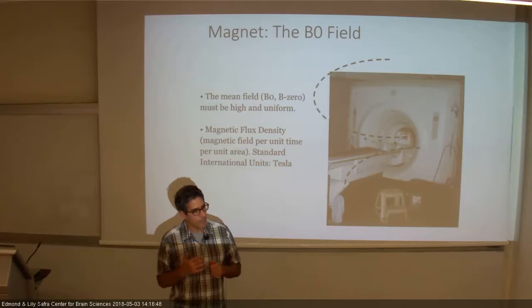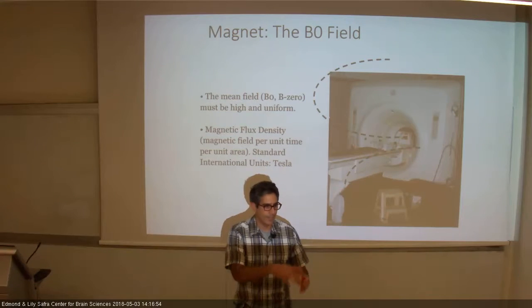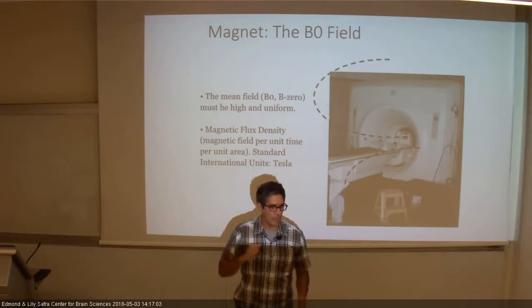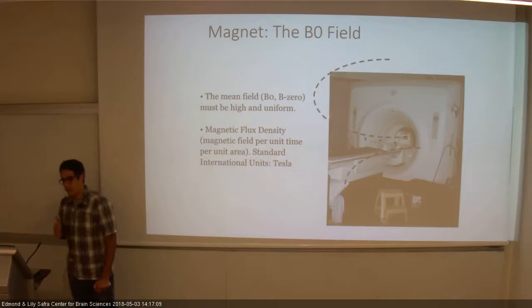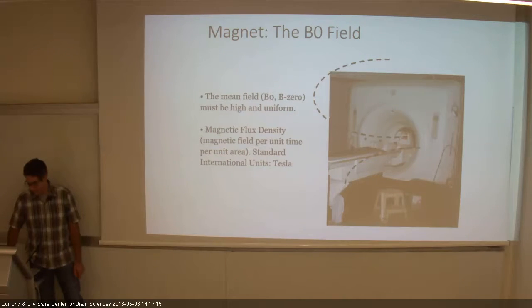And in the early days, there were some instances, mainly in the hospitals, when people came with, let's say, big balloons of CO2 or O2 which are metal, and they just flew into the magnet, and there are people who died because of that. That's rare. Currently, it's very rare that those things happen, but we should be always cautious. That's the main risk in MRI, metals.